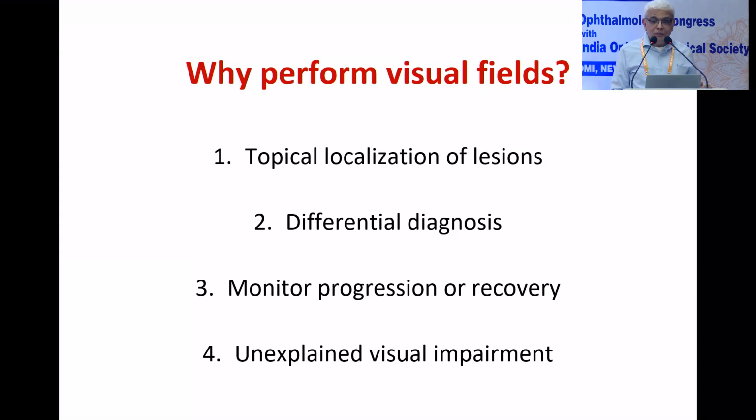We can also monitor progression and recovery. For example, if you're treating someone with steroids, is it getting better? IIH patients or thyroid disease with compressive optic neuropathy, you're following up these patients with fields. So that's another reason to do fields. And lastly, and not the least important, any patient with unexplained visual impairment deserves a visual field analysis.